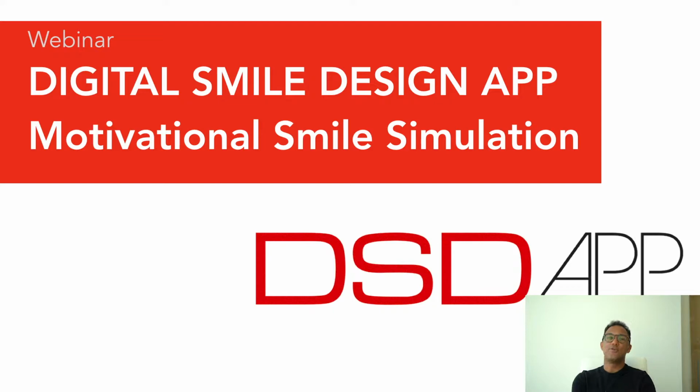In this webinar, you will learn how you can design the most beautiful harmonic smile designs within 5 to 7 minutes to get that exciting yes.